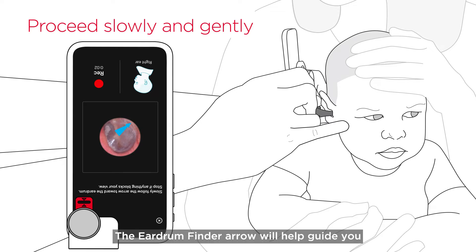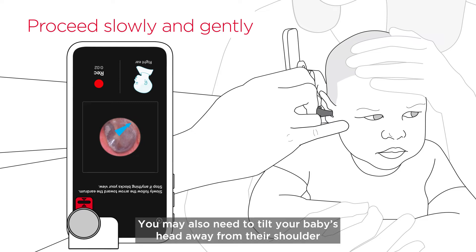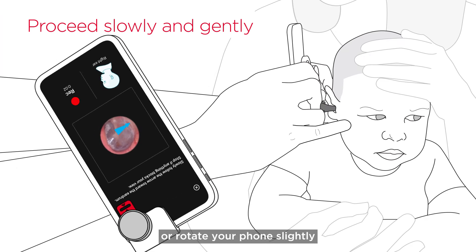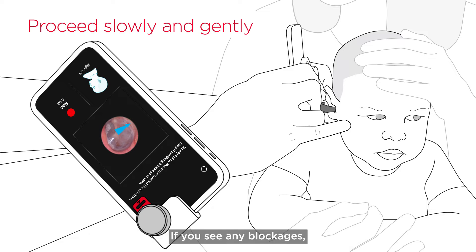The eardrum finder arrow will help guide you by pointing in the direction you should move the specula tip. You may also need to tilt your baby's head away from their shoulder or rotate your phone slightly to more easily and comfortably access the ear canal. If you see any blockages, stop using SmartCheck and contact your health care provider.